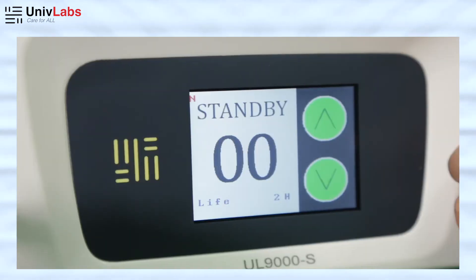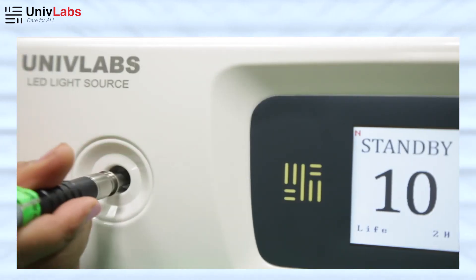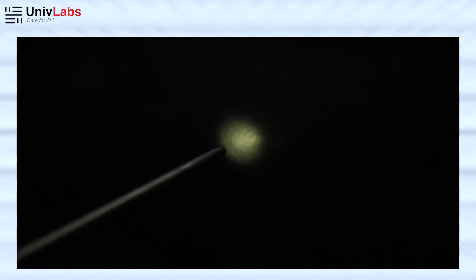When you choose one of the options, it advances to the next window and will give you two more options: Standby Mode and Active Mode. When you insert the fiber optic cable, the machine detects the cable and switches to Active Mode automatically. You can now start with the procedure. You can also increase and decrease the intensity of light during the procedure in 5 steps from 0 to 100, and you will see the change in light intensity at the scope end of the fiber optic cable.